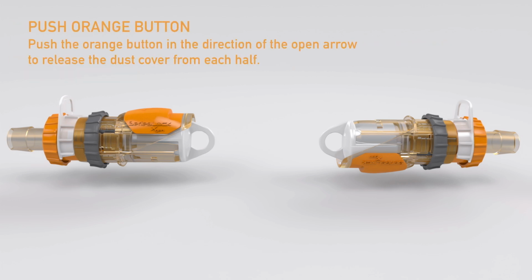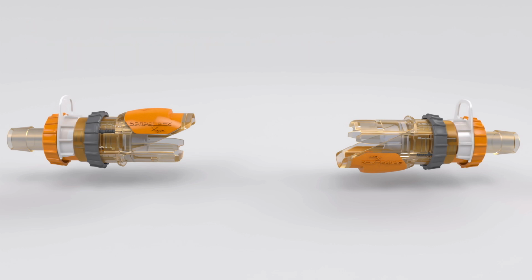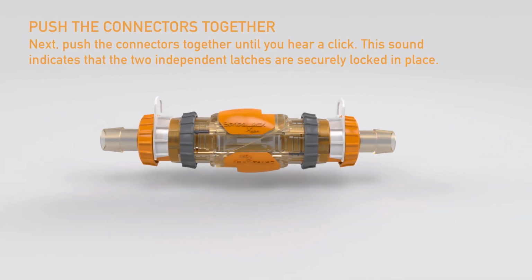If the optional dust cover is installed, begin by pushing the orange button in the direction of the open arrow to release the dust cover from each half. Next, push the connectors together until you hear a click. This sound indicates that the two independent latches are securely locked in place.